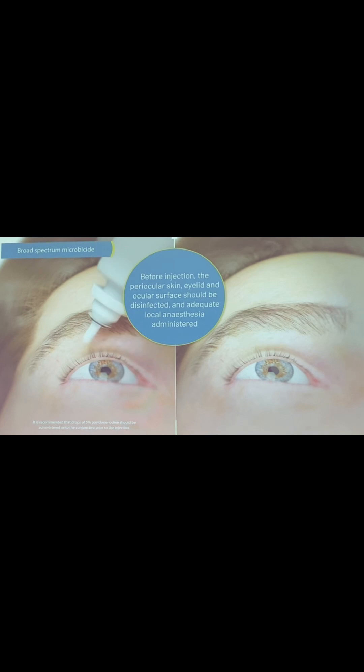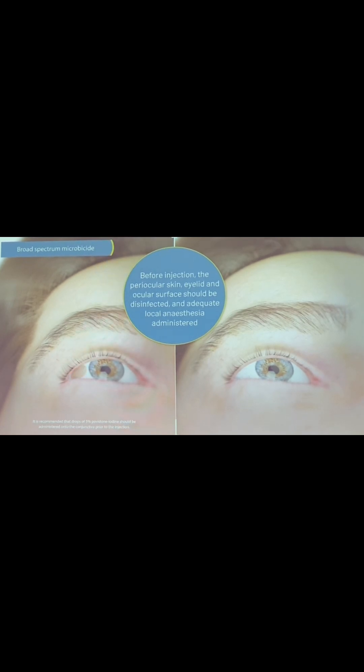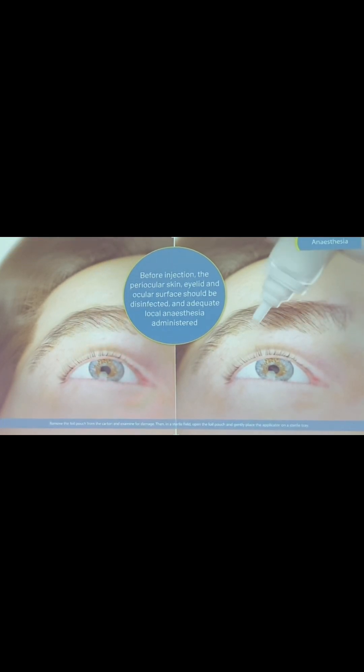Before injection, the periocular skin, eyelid, and ocular surface should be disinfected and adequate local anaesthesia administered.